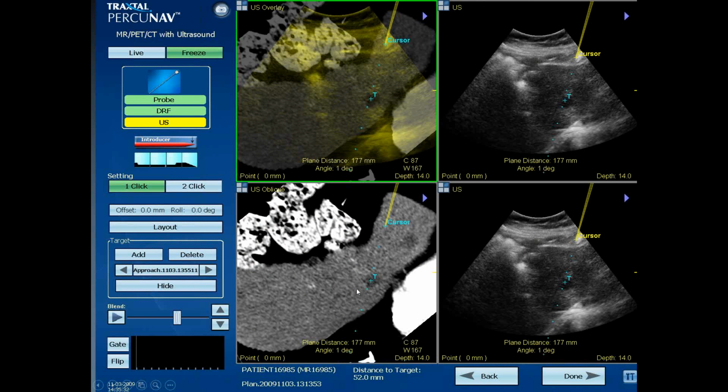Okay, and then you can fuse images, for example. You can fuse the ultrasound image with the CT image. So this is the ultrasound part. Say it's a liver lesion. It's a CT part. This patient had a partial resection, so you have a lot of bowel coming in and obscuring your image. Even though you see the target here, this is for teaching purposes, just so you see what's going on. This patient would not need any navigation because you see the target already with ultrasound alone, right?